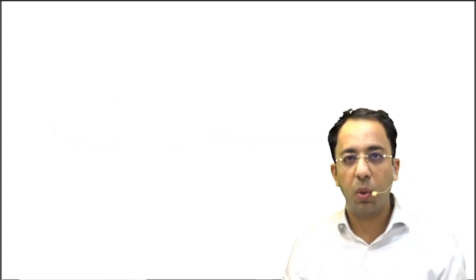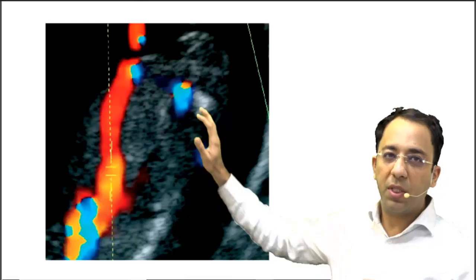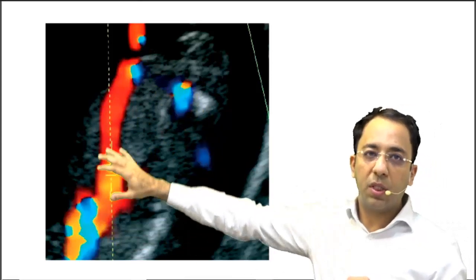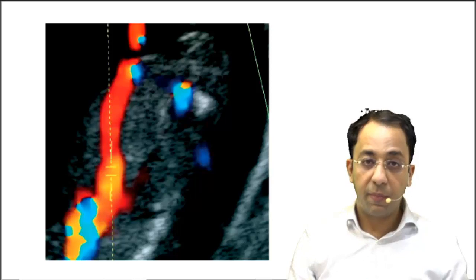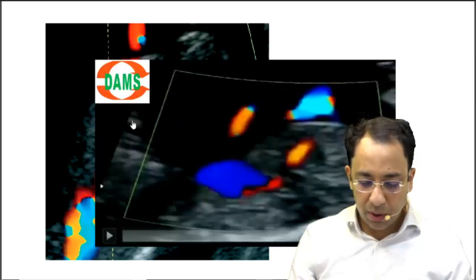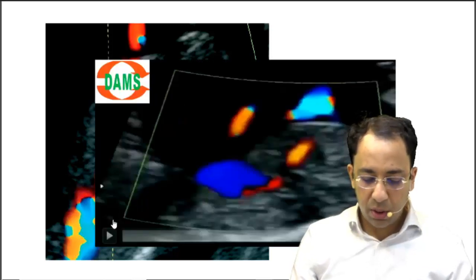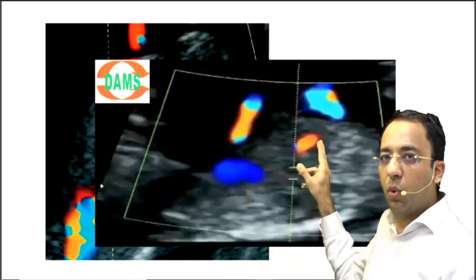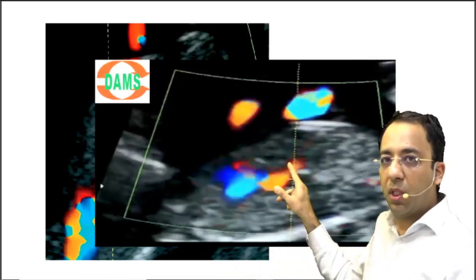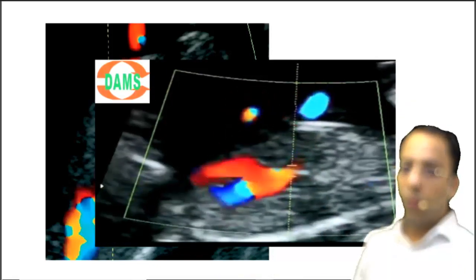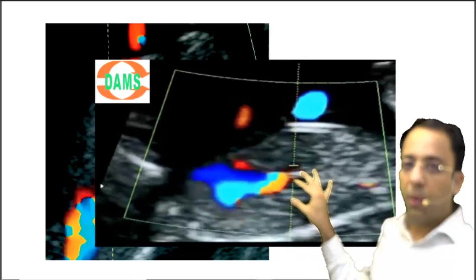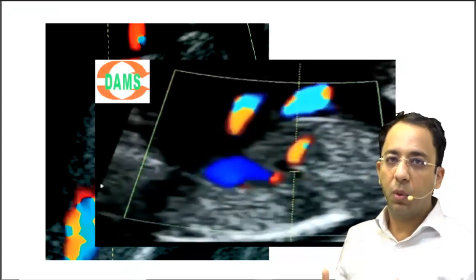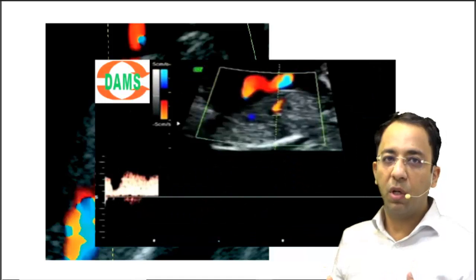I will show you how it looks. This is how the sagittal image of the fetal abdomen looks, and this is how you will see the ductus venosus. When doing a Doppler, this is how the imaging would look. In the live imaging you can see the ductus venosus here, and when we put on the pulse Doppler we are trying to see the waveform — the waveform will reveal itself to you.